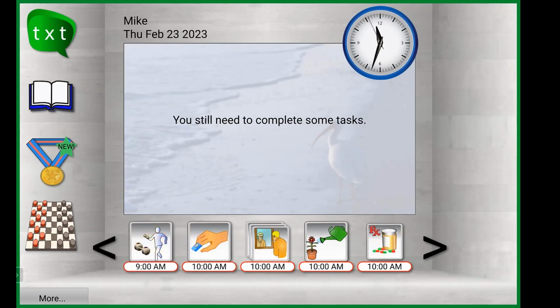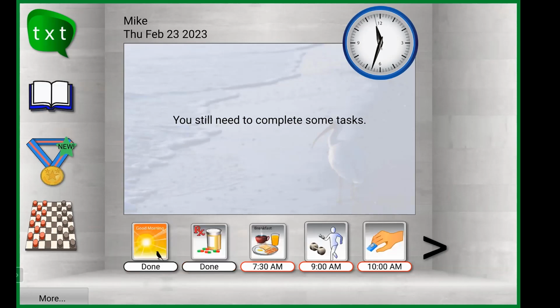So as I discussed, that virtual care team is standing by underneath this tablet, and what ultimately makes Sensio and Ibis special and unique is an artificial intelligence engine that is sorting through all the data and generating the moments in which your health status starts to deviate based on the data that you've registered into your tablet. Let's role play an example of an Ibis member who has COPD, lung disease, and uses a device to help with their breathing, whether that's CPAP or some oxygen.